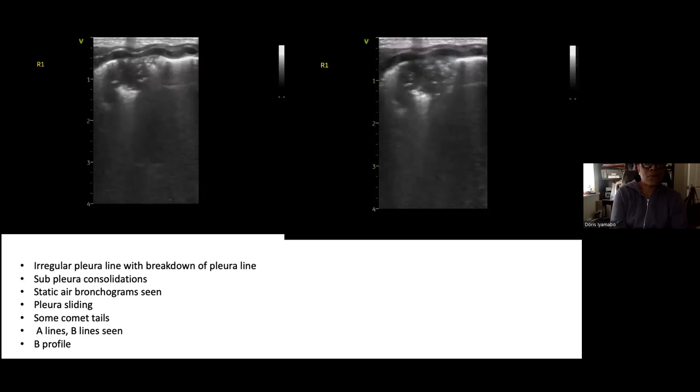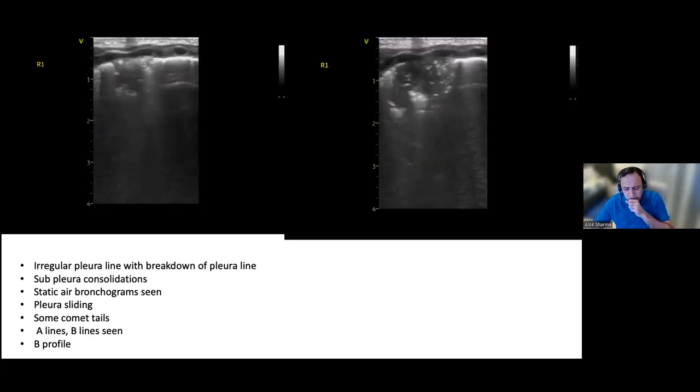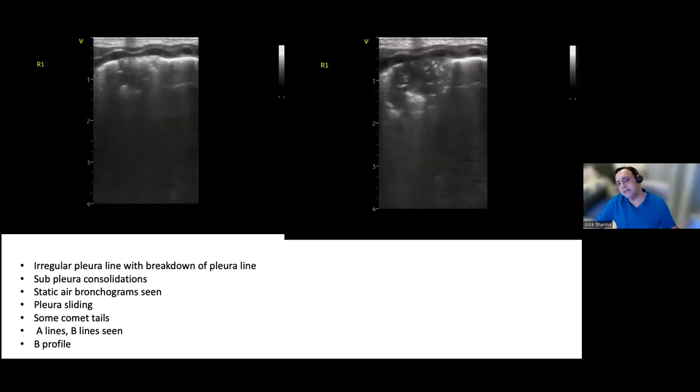So the GE, is it the GE95? Which machine? The X5? I'm not sure. Okay. So it doesn't use focus. It basically gives you the delineation and improves focus at every area. But just be careful. If you're using a low frequency because you're not focusing on the pleural line, you might sometimes have dropout because of that. So no harm in just putting the frequency up to see the pleural line and then dropping it to see the depth.